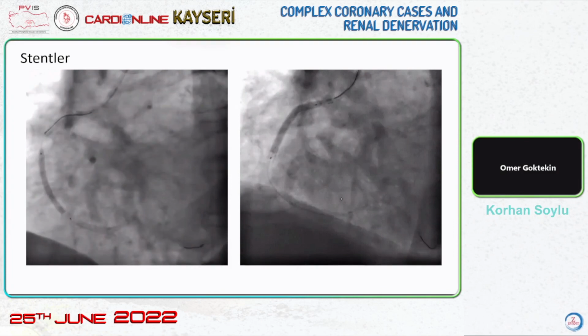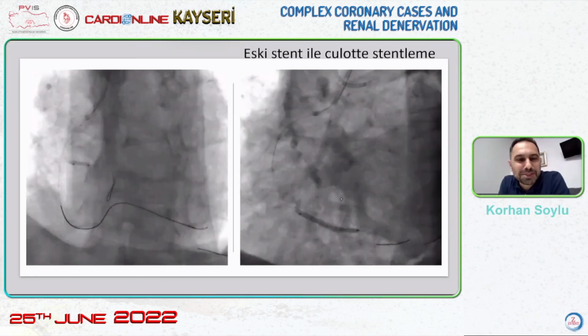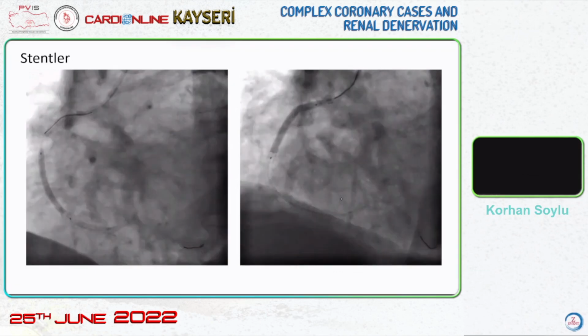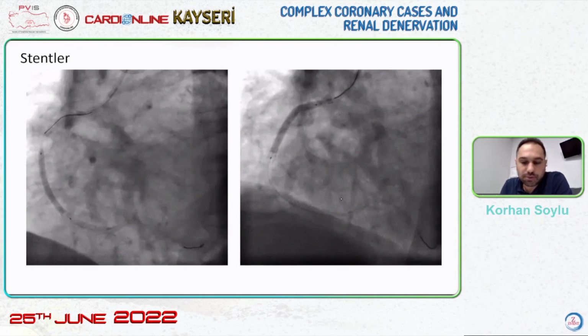What was the latest wire? This is a case I did 1 year ago. I couldn't see it in my notes, but I guess I used Miracle. Because I do not remember, it was a case 1 year ago, but when I look at the wire, I think I used Miracle. But here, a polymer jacketed wire could be used.